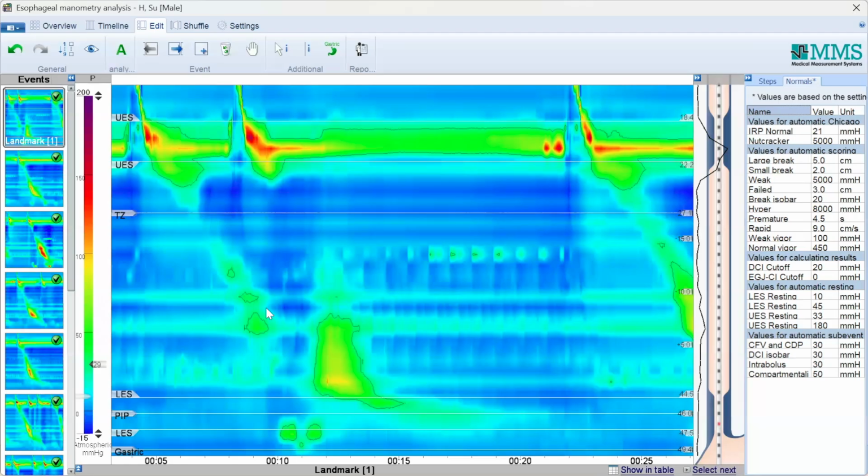We've inserted this catheter. How do I know how far in I should go? Exactly. When we start to insert from the nose, at the same time we ask the patient to drink some water. Drinking water helps the UES, the upper sphincter, to open, then the probe can go through easily. Then we go down. During the insertion, we are monitoring on the screen.